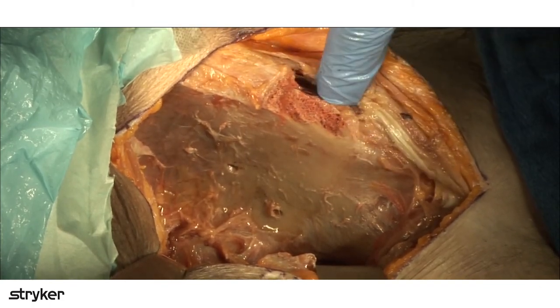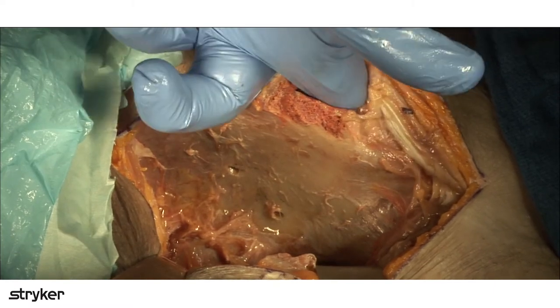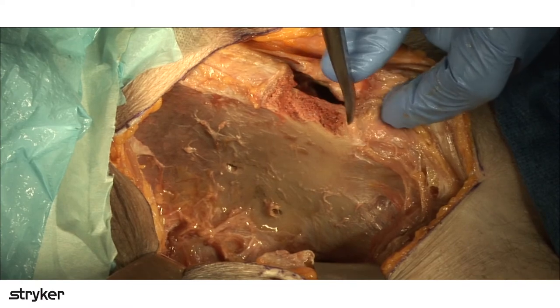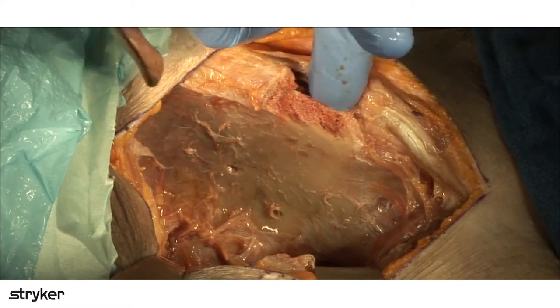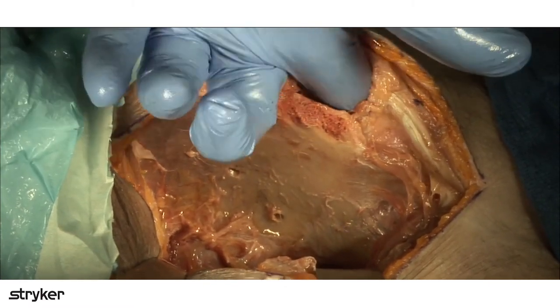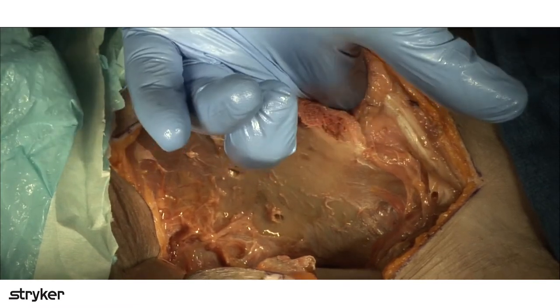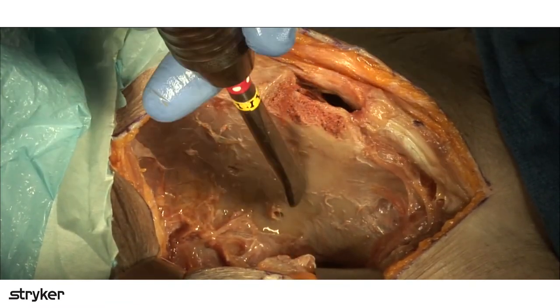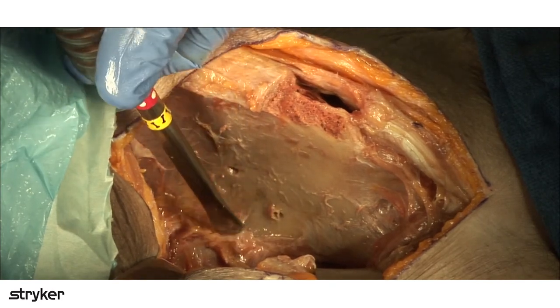It also allows you another quarter to pass a clamp because you've opened up into this interspinous notch, which is right here. It opens things up to where you can actually pass a clamp around the outer table if necessary, and you're not blocked as much by the abdominal fascia and abdominal contents.